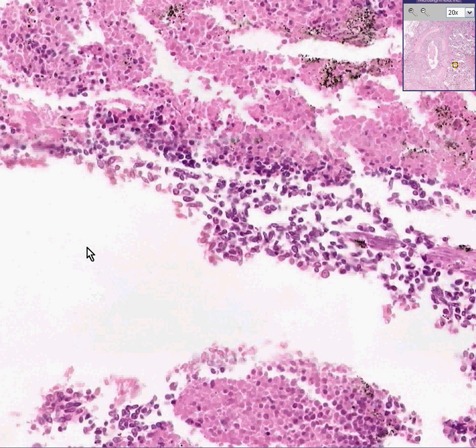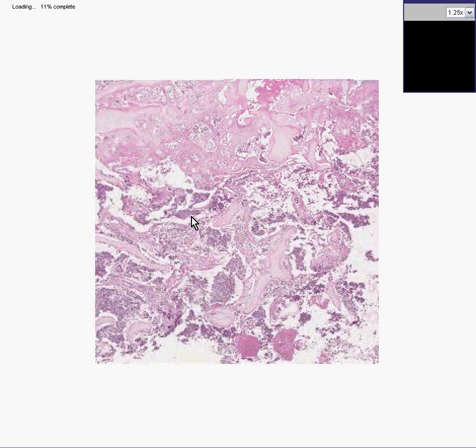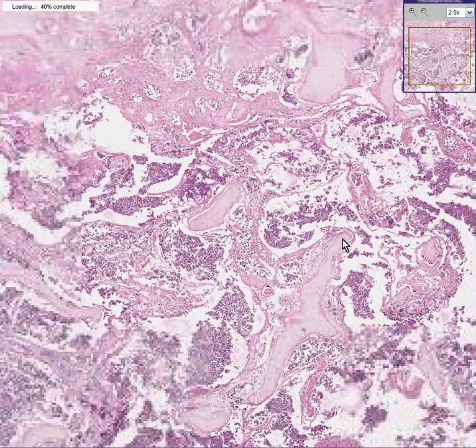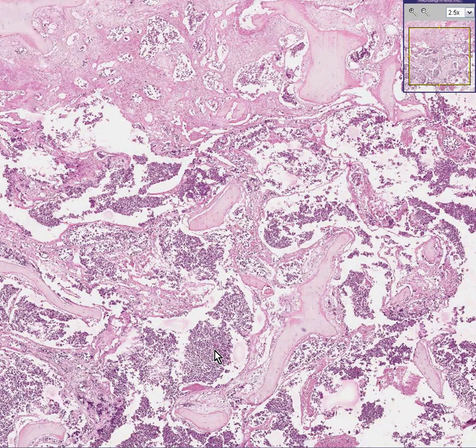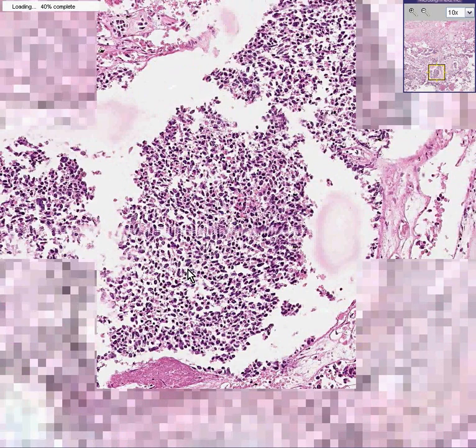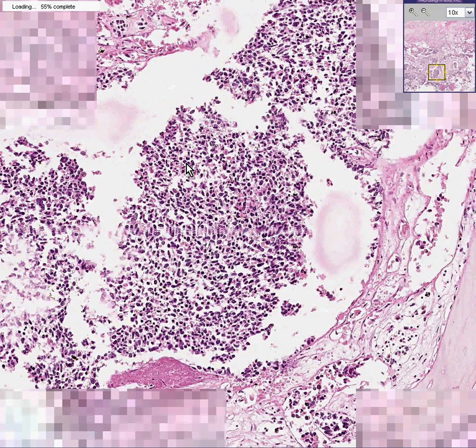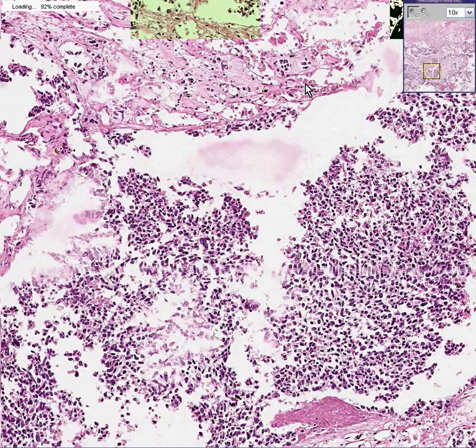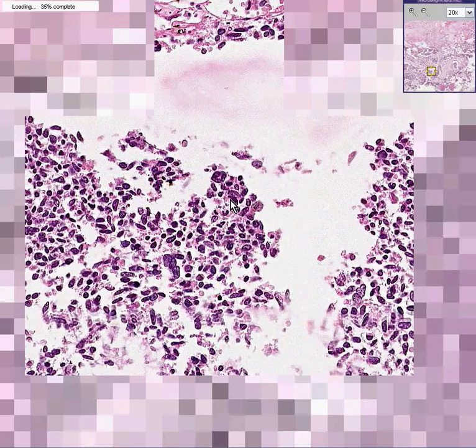Let's look at another area. I think it's bone, because you could see generated spicules here. So this tumor has metastasized to the bone as well. The cells look very much like they did in the liver, in that they have very small nuclei and extensive necrosis. And just to keep me honest, let's find another area which we called nuclear molding, in which the nuclei kind of bent or conformed to each other to form kind of a ball, like they do here and here.